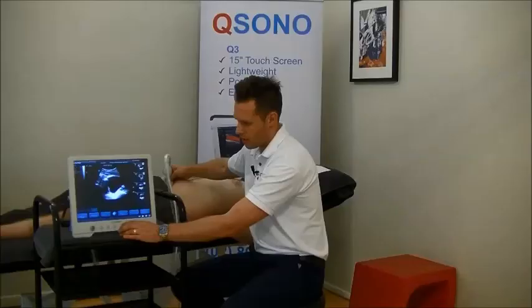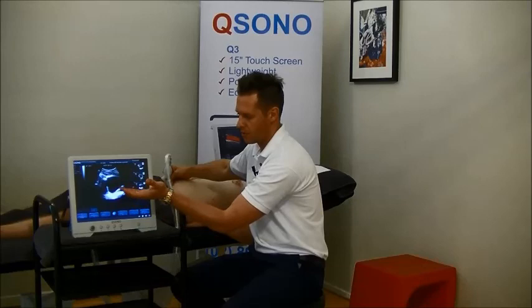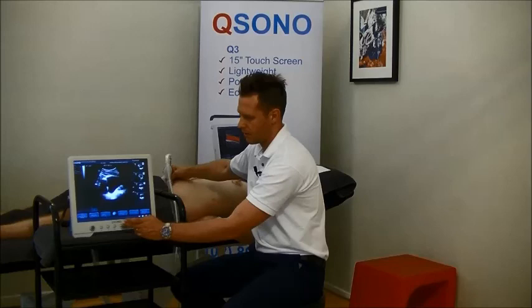So now what we're looking at here is the posteroinferior wall of the bladder down here, and we're able to see on this view not only posterior to anterior movement, but also caudal to cephalic movement as well. So what we're going to focus on is this part of the bladder wall down here. Can I just get you to do a little contraction there for us, please? And you can see it elevating and relax. And just one more time. And relax.